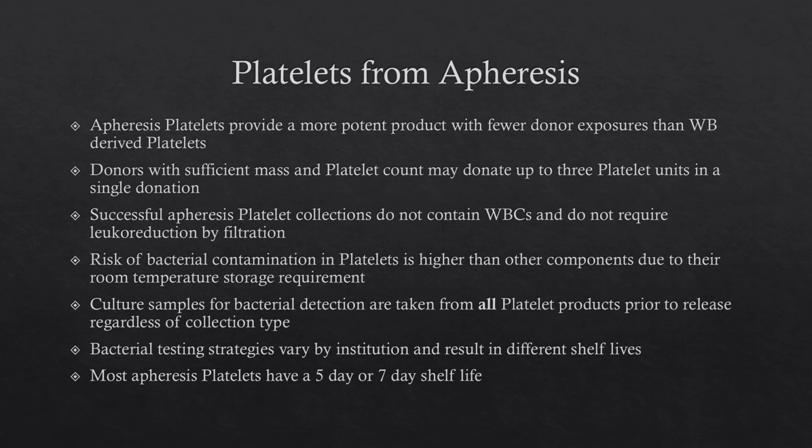The risk of bacterial contamination is always there with platelets because of their room temp storage, and the chance for bacteria to proliferate is there. So we must culture all of our platelet components and give them time to incubate and ensure, or be as sure as possible, that the platelet components that we're sending to the hospital are not contaminated with bacteria.